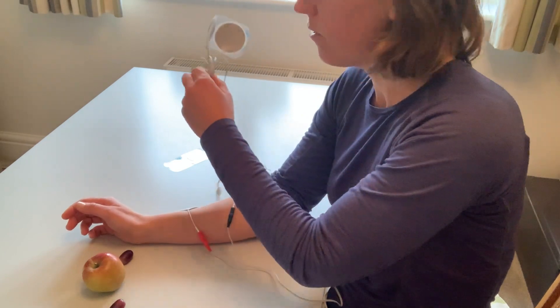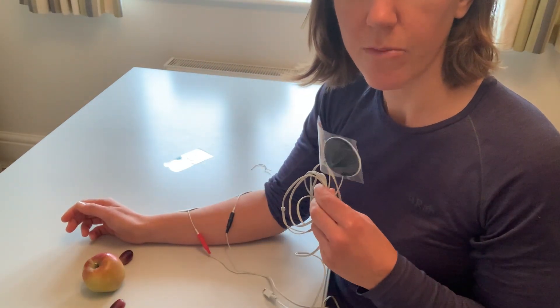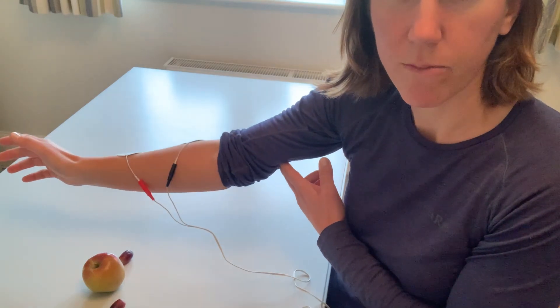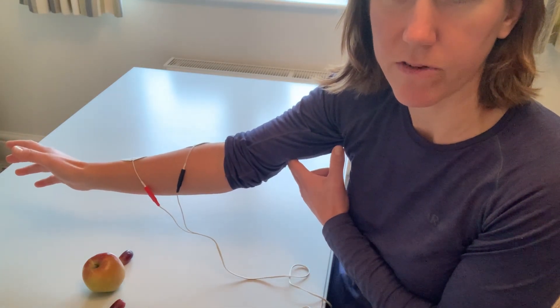Another option, if your stimulation device like the Stim Pro allows you to, is to put a second lead in and place the electrodes on the back of your upper arm, so that you could also get elbow extension at the same time — which will really help with that nice reach movement.